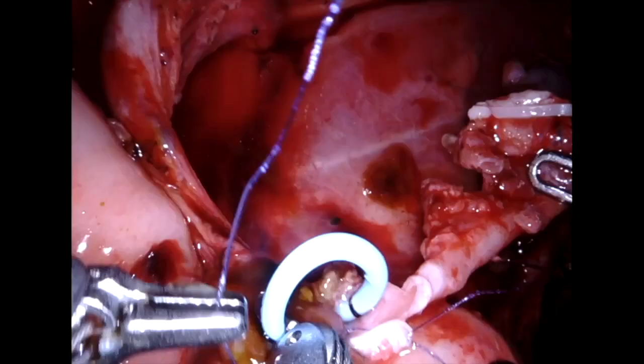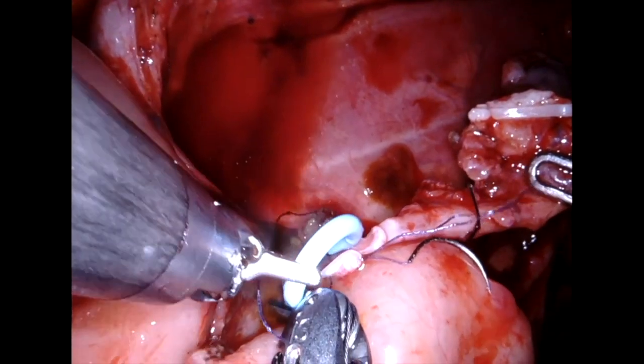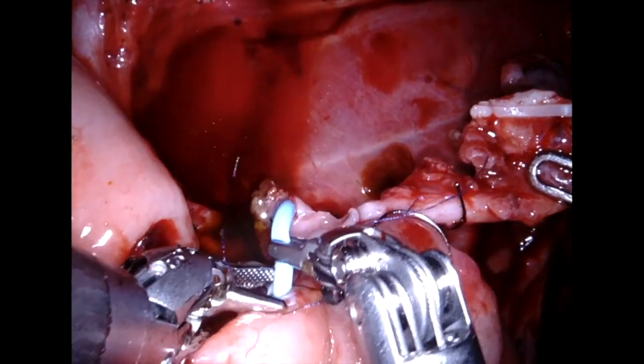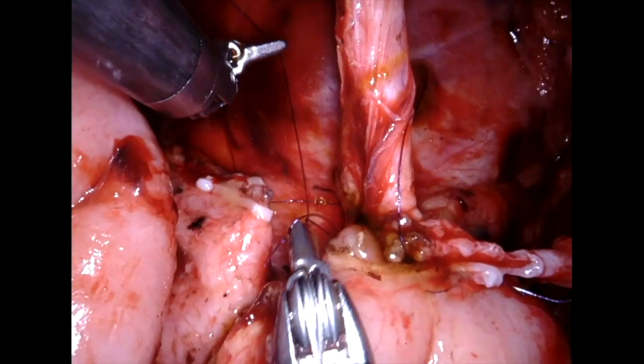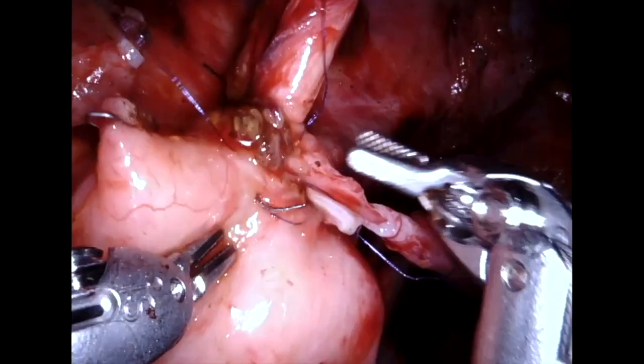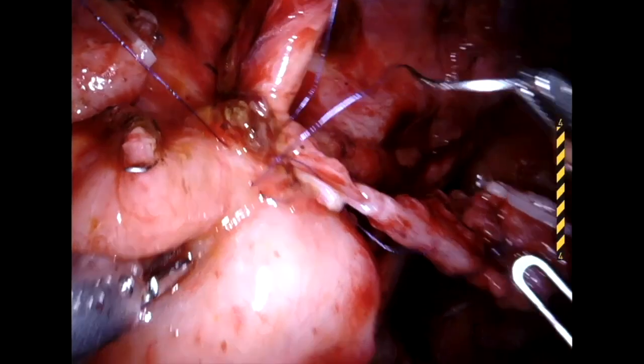Once the stent is placed, we complete the anterior wall circumferentially, taking sutures and completing the anastomosis between the ileal loop and the ureter.